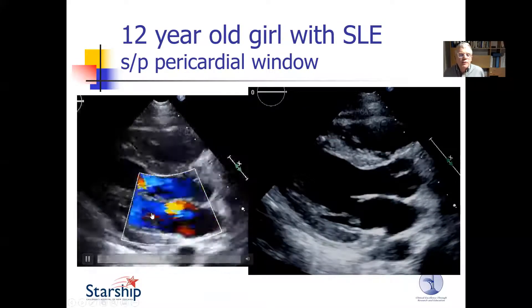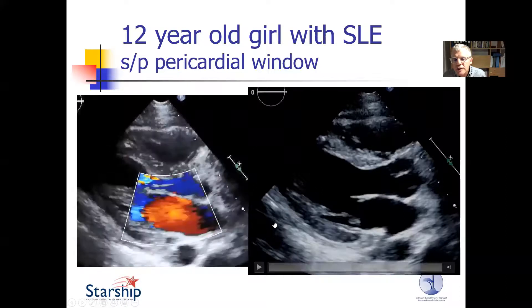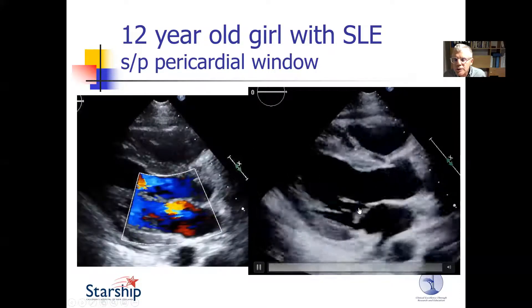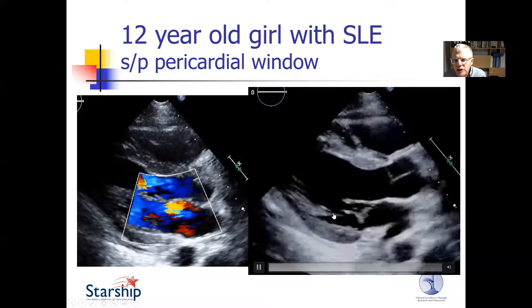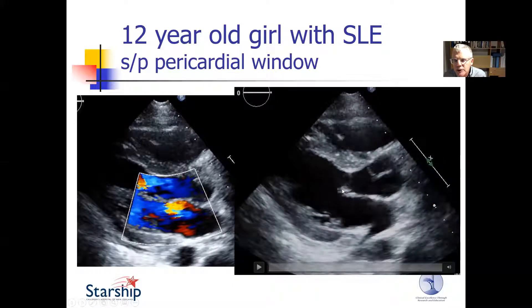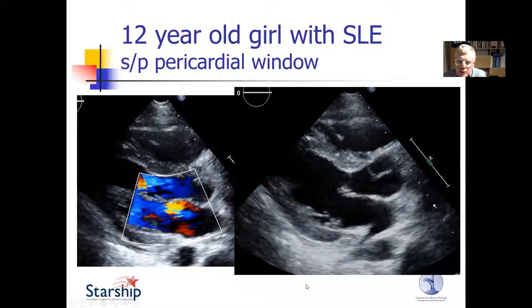This is a 12-year-old girl who initially presented with pericardial effusion, but also had mitral regurgitation that is not insignificant. If we look at the mitral valve, the leaflets are thickened, and there's something sitting at the anterior leaflet coaptation junction. When we stop the echocardiogram, we can see there's a discrete little mass there, which is probably one of these Libman-Sachs vegetations. It's easy to over-read things in an echocardiogram when looking carefully.